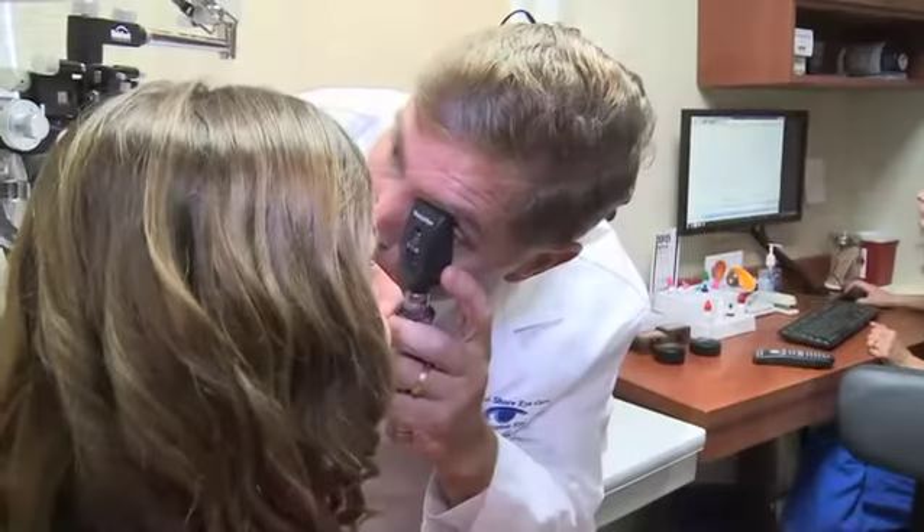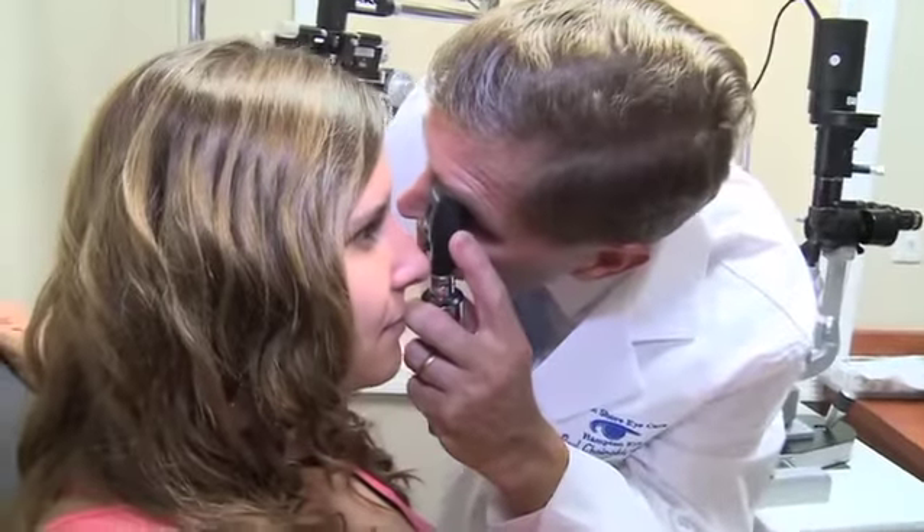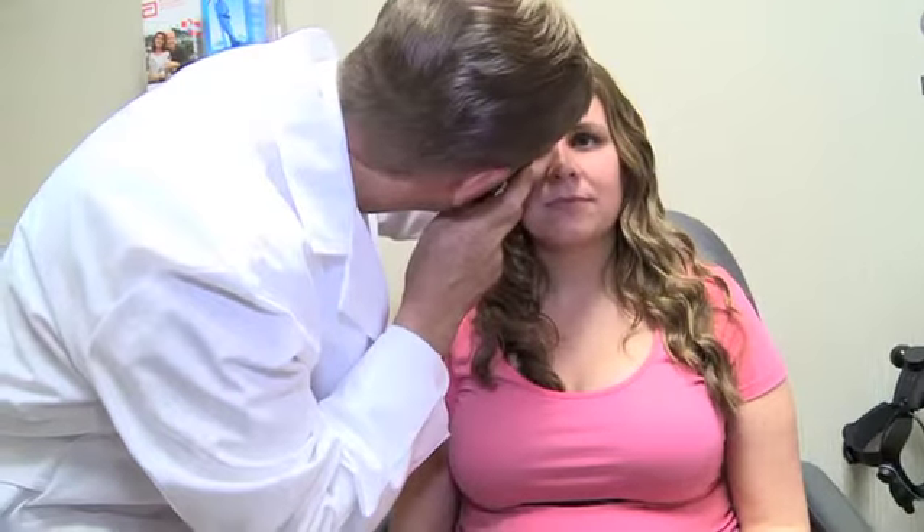When the patient first arrives at the hospital or ambulatory surgery center, their eyes are cleaned and they're given dilating drops. They're then brought into the operating room where a little bit of sedation is given to take the edge off. The nurses get all the instruments ready, the microscope is focused, and then the surgical procedure begins.